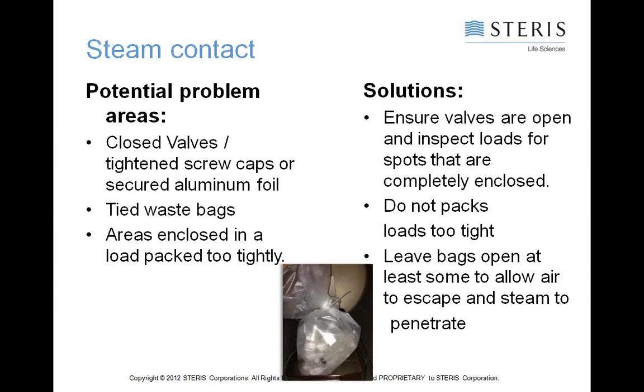And of course, the other thing is, as you look at your load, anywhere where an area is enclosed very tightly or the load is packed very tightly, could be an area where steam is going to have a very difficult time contacting. So, make sure valves are open. Inspect loads for spots that are completely closed off. Don't pack loads too tight.